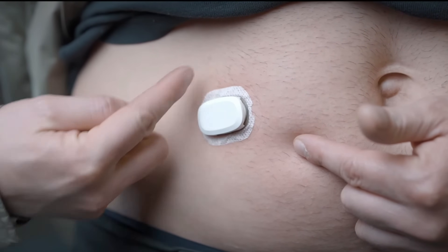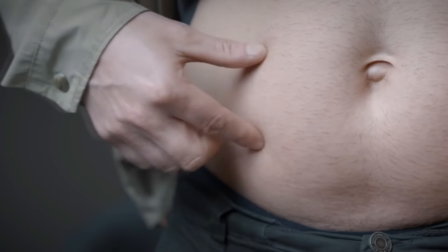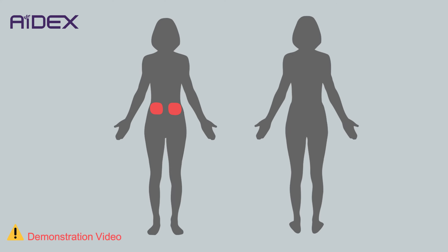The selected area should be free of wounds, moles, tumors, and hair, and should have a slight fatty layer. It is advisable to alternate between these areas.